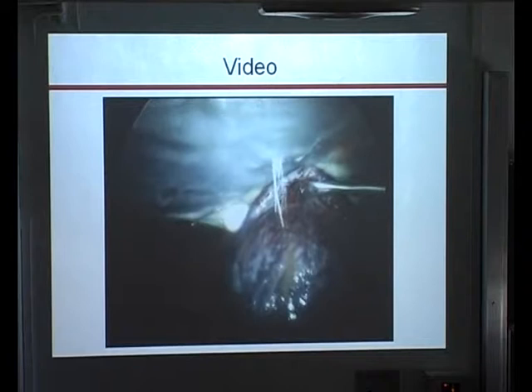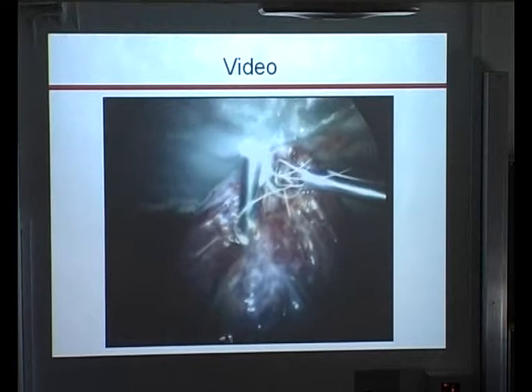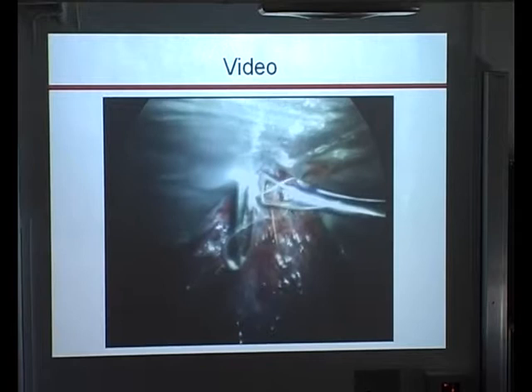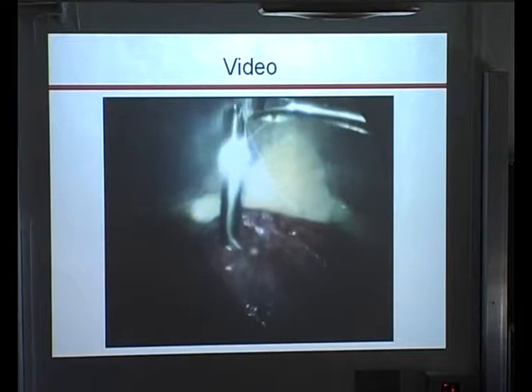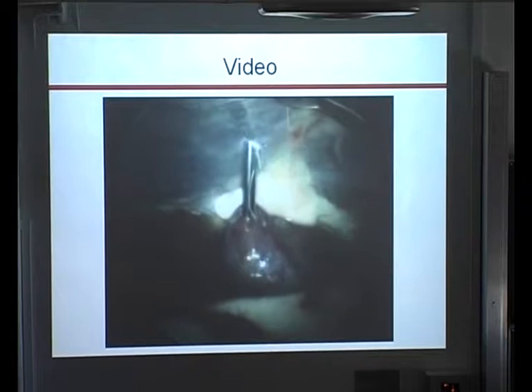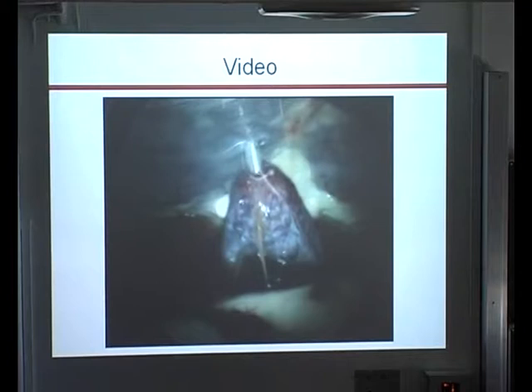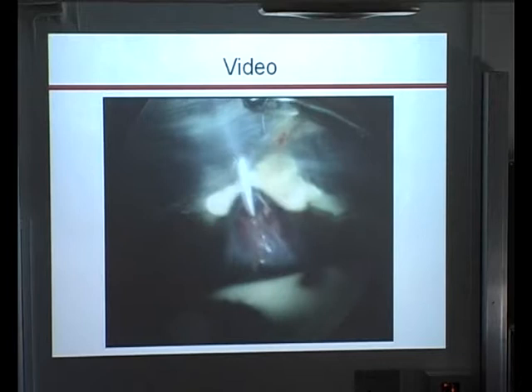Don't worry about these structures. This is hair. This animal was dead, so we were just practicing. So the trocar is in the bladder now, and then you can block the balloon. You should use about 8 to 10 milliliters of fluid to block the balloon of the catheter. So then you can remove the trocar, and here you can see the catheter coming out of the bladder. Okay, and then you can pull the bladder near to the abdominal wall.